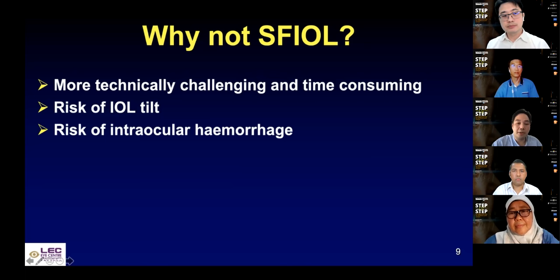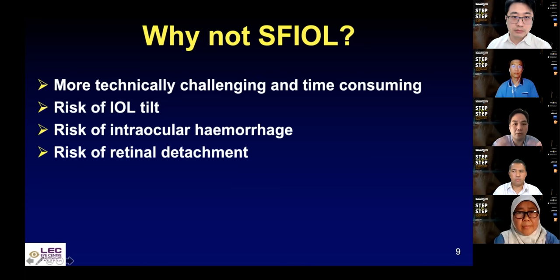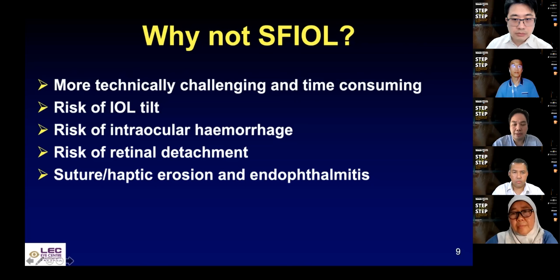The risk of tilt, risk of intraocular hemorrhage. I think Dr. Noliza very aptly showed potential problems, which can be a whole basket of problems, like entering the sclera with the needle at a different angle, and you cause an iridodialysis, catch the iris root, and you can get bleeding into the eye. Worse still, you can get a suprachoroidal hemorrhage, and of course retinal detachment, haptic or suture erosion, and endophthalmitis. These are all reported consequences of scleral fixation.